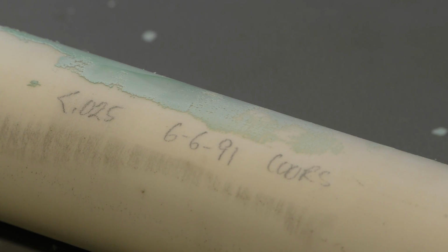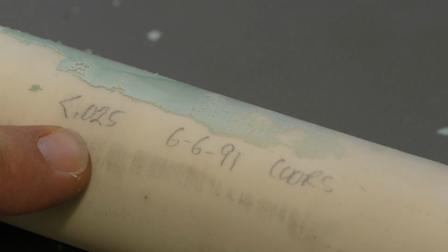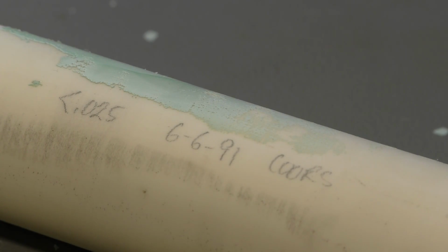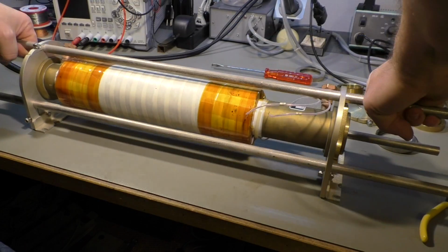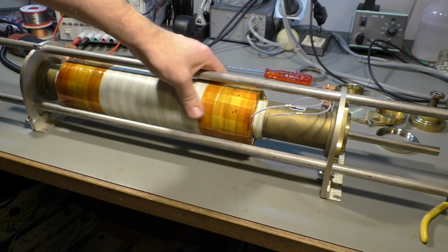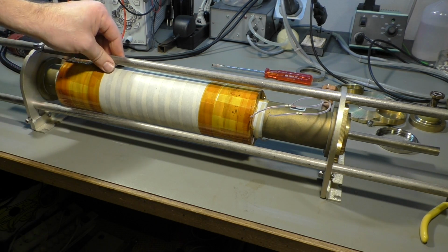Funny detail here, some person with the name Course has assembled this tube on July 6th, 1991, and he measured something. It is less than 0.025. I think it's inches, maybe millimeters. I don't know what it means, but that's certainly the day when this tube was manufactured. It's amazing, but this part here is still relatively heavy. I think most of the weight is this copper coil here, which seems to be quite massive. Let's see if we can remove that somehow.